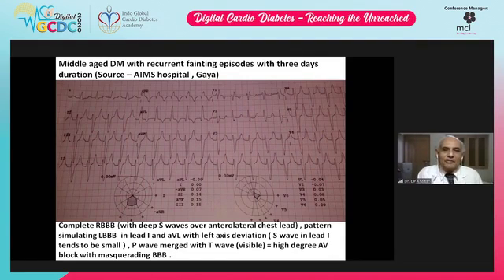The P wave is merging with the T wave with a somewhat prolonged PR interval. So this case has a prolonged PR interval plus bifascicular block. Ultimately, the patient required a permanent pacemaker, and we investigated further, and ultimately he needed revascularization therapy. This sort of bifascicular block is present on ECG when there is diffuse conduction disturbance due to any illness of the left ventricle, or a 3-vessel disease. In this patient, there was evidence of 3-vessel disease.